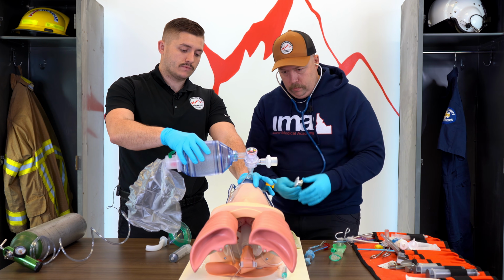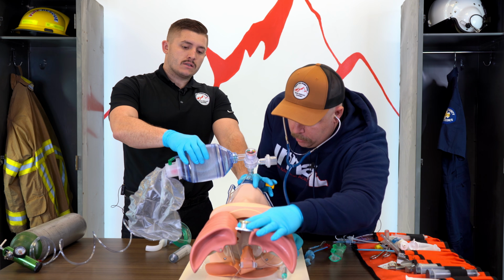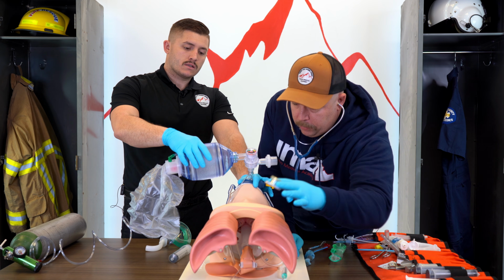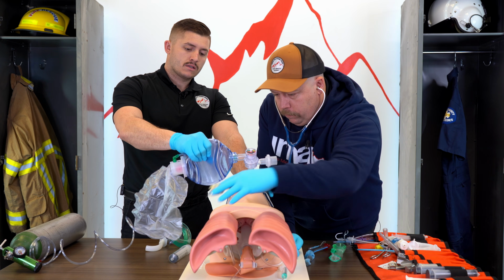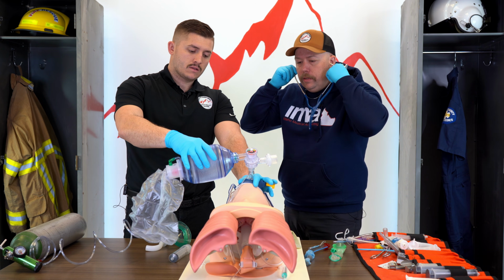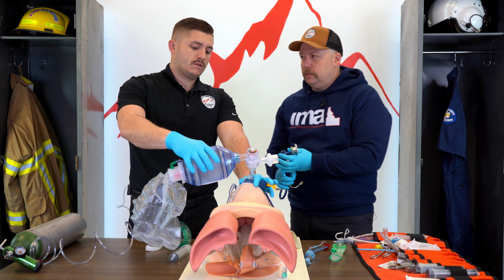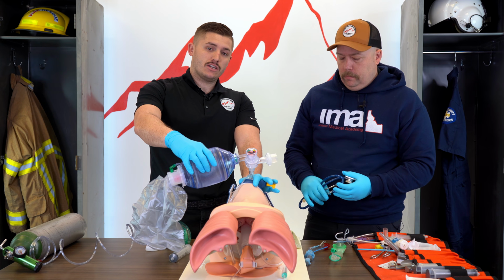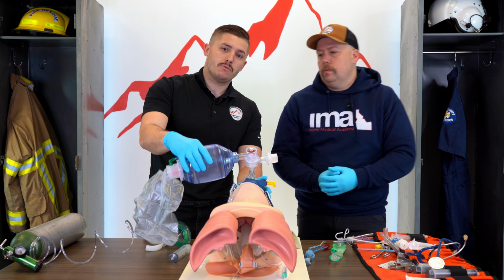All right, so we'll check the stomach. Give me a breath. Confirm that there's no air in the stomach. Then we're going to check the lungs. Breathe for me, and breathe again. Confirm that we have good airway sounds and continue to ventilate one breath every 5 to 6 seconds. Copy that. Again, I can continue ventilating this patient while Chris does other paramedic stuff to help out our patient.